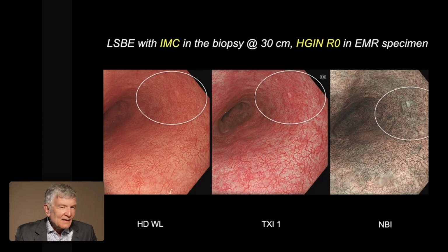It is, and this opens, I wouldn't like to go in depth, but there's always the advice from reference centers: don't biopsy, just look. But if you don't have experience, good instruments, and you don't have the selection, it's better to take more biopsies than to say there is nothing and not take biopsies.